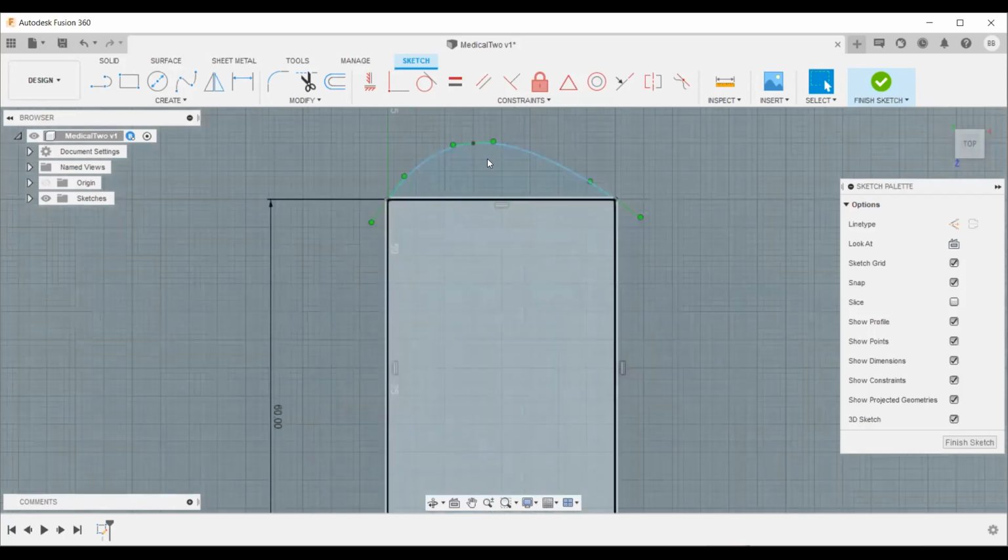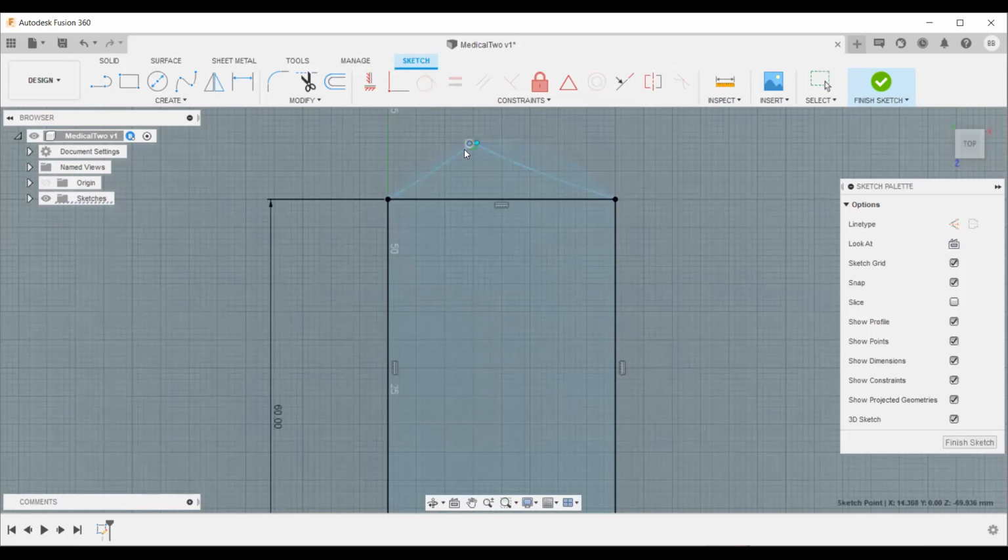Guys, can you see that? Yes. Then you make it smooth. It should be perfect, somehow like we could use a circle, but I just wanted us to use this spline. You can play around with it. It will make funny things for you. But if you want it to be a perfect circle, you could use a circle. I'm going to show you how the circle part works.